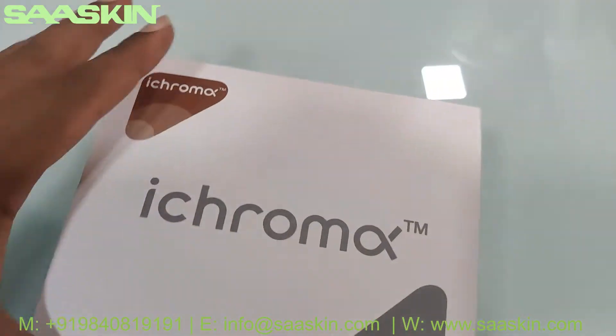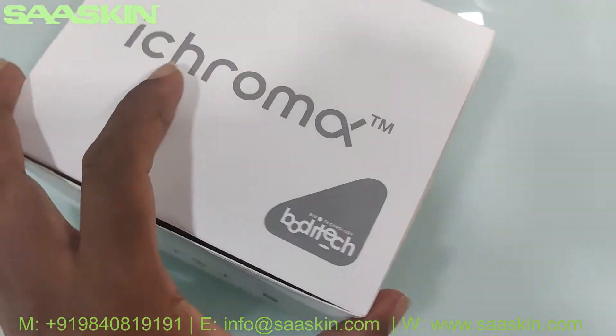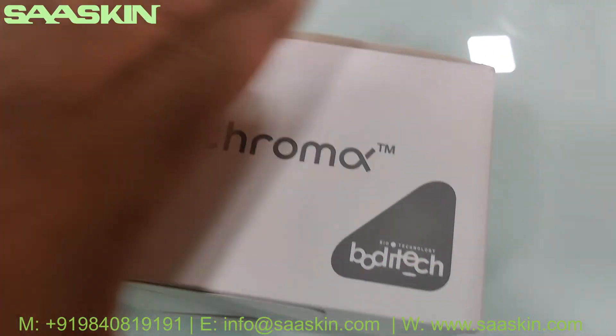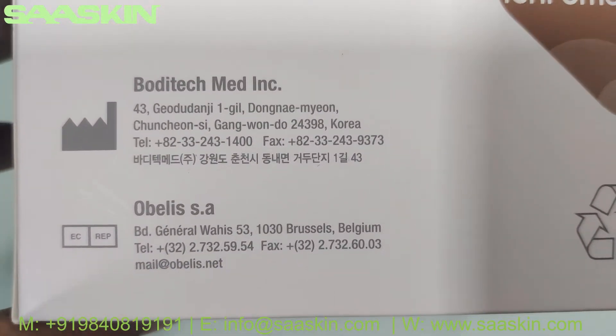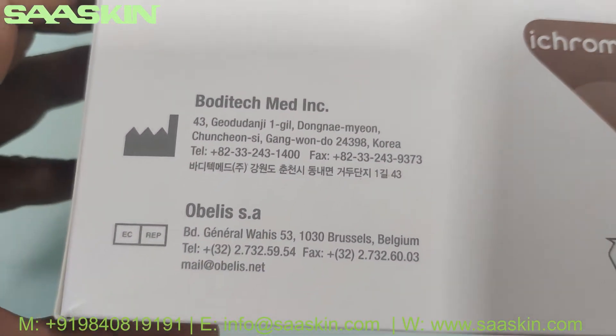Let me show you the box — this is how the box looks like. On the other side you can see it shows the manufacturing from Korea, Boditech, Med Incorporation.